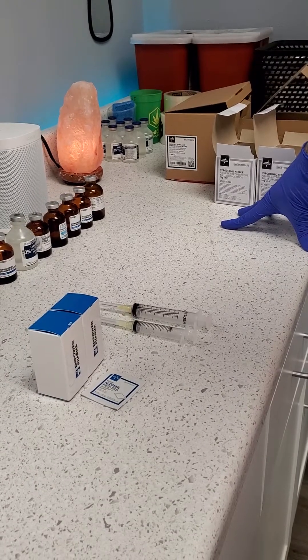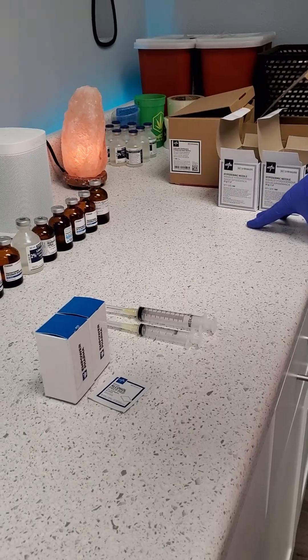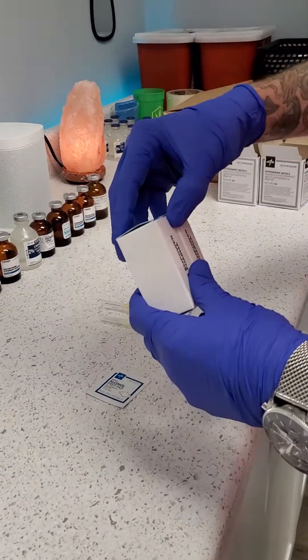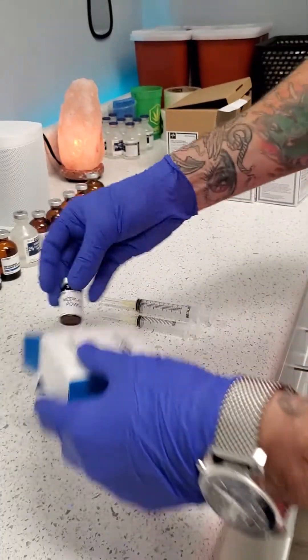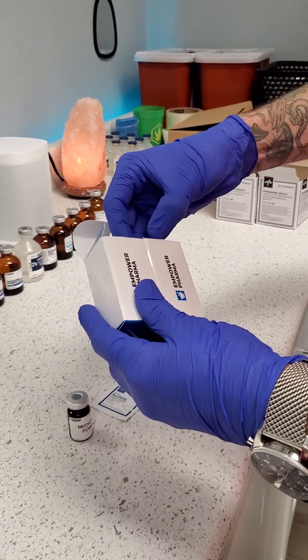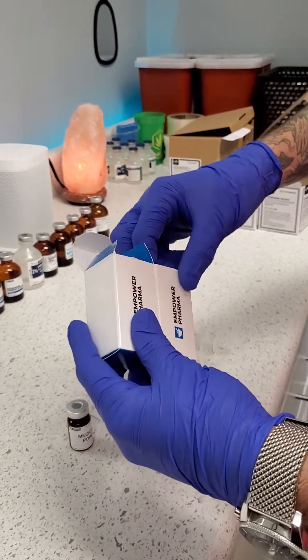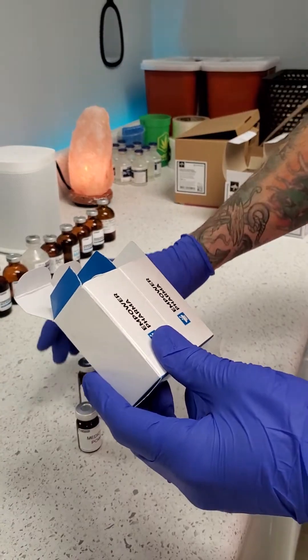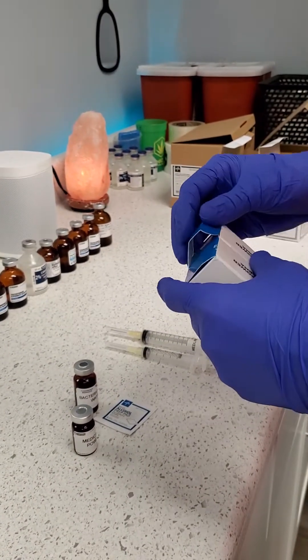All right, so today we're going to do a video on reconstituting 5 milliliters of bacteriostatic water into powdered medication. This can apply to a lot of different kinds of meds, but generally things like Trimix, Cermorelin, Ipamorelin — different peptides are going to come as a lyophilized powder and that powder has to be mixed with bacteriostatic water. They do this so that the shelf life of the product can be extended.